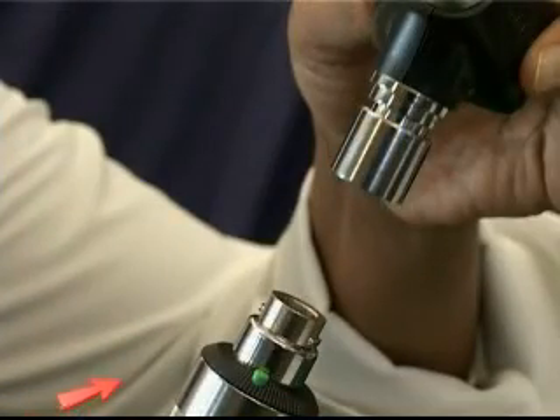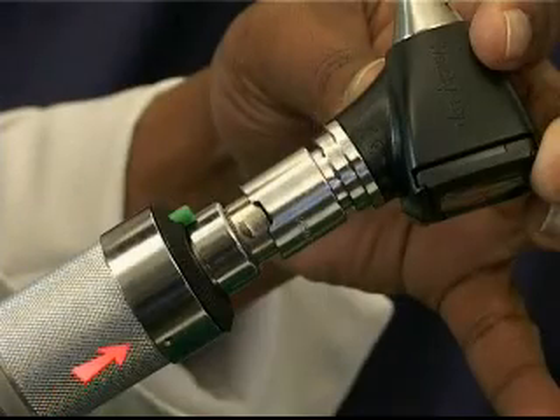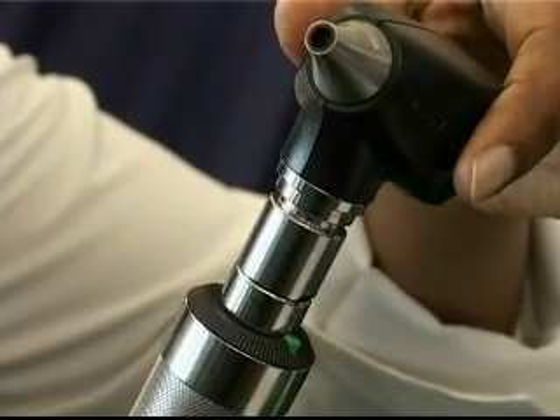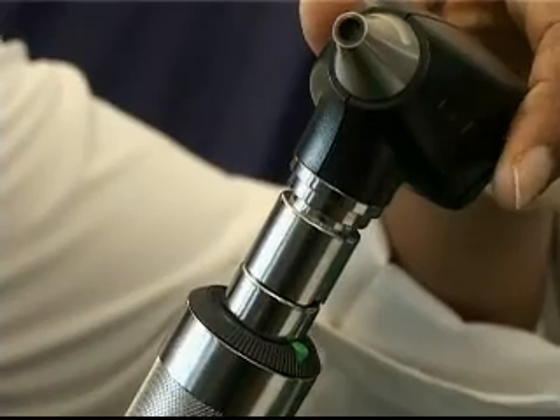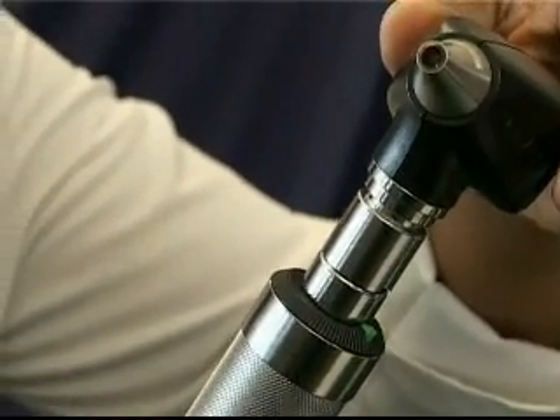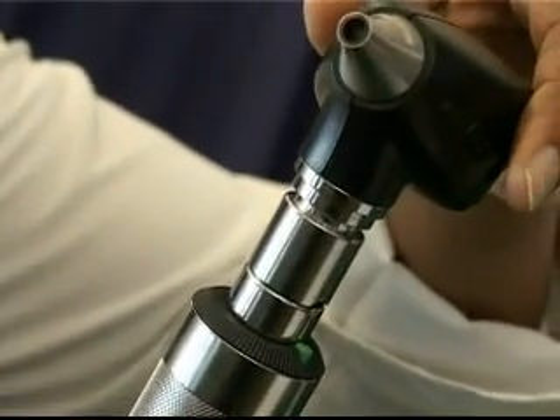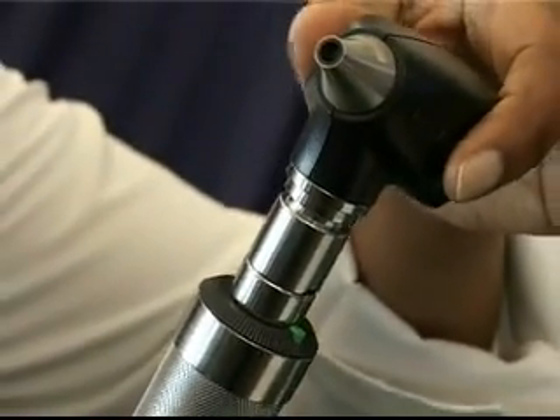There are two locating pins on the neck of the power handle, and on each attachment there are two slots. Ensure that these are located opposite each other when attaching any head to the power handle. Gently push down and twist to the right for attaching, and gently push down and twist to the left to remove an attachment.